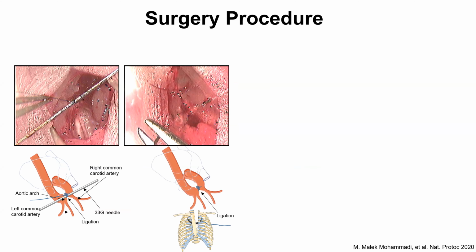Then you can use your absorbable suture to suture the ribs. Make sure that you are suturing between the ribs, the muscle between the ribs, and not damaging the ribs, because this might also be harmful and lead to mortality.